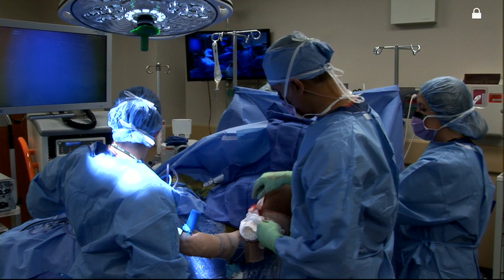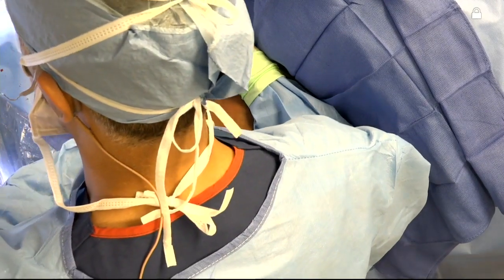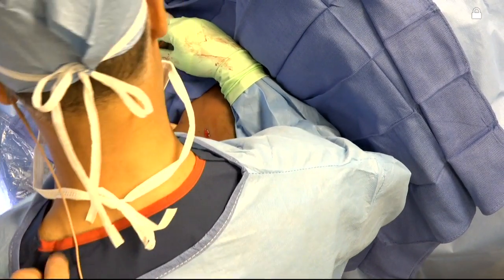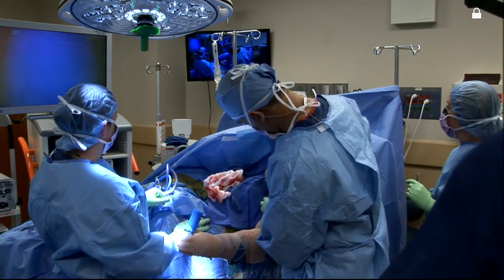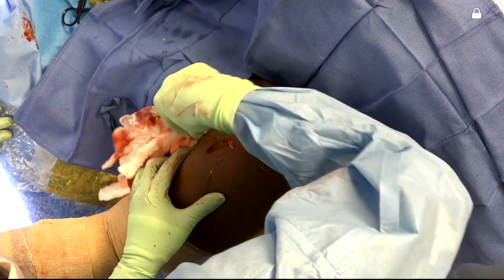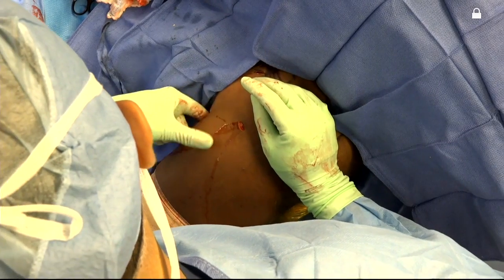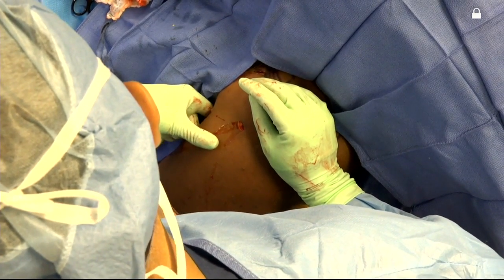Dr. Verma, you want to show us how to fix the biceps? Yeah, Tony. So we sat her back and she started to have some hemodynamic issues, so I actually had to go ahead and do it because they want to try to get her out of the OR pretty quickly. What we did was we made a small incision in the axilla. You can make this fairly cosmetically in the fold just under the axilla at the inferior border of the pec. Then using my finger, I simply sweep between the pec major inferior border and the short head biceps.